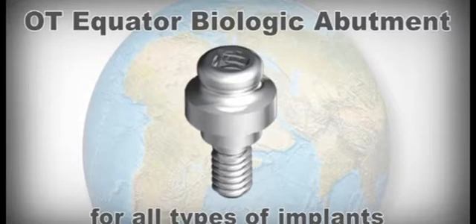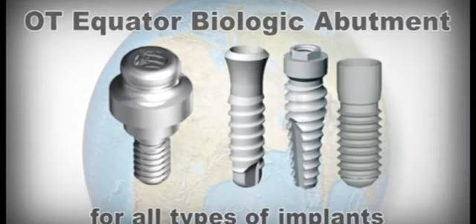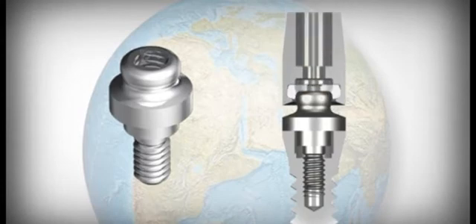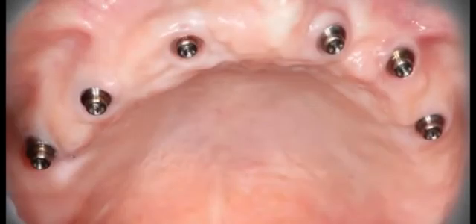The OT Equator attachments are built for all types of implants in use in the world. By taking advantage of the characteristics of the equator sphere and combining them with the use of the Seeger springs, a new technique of complete biological implant prosthesis was born.